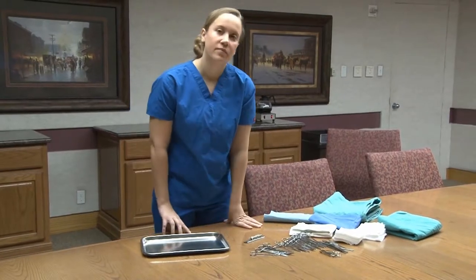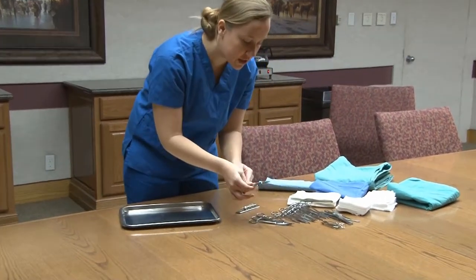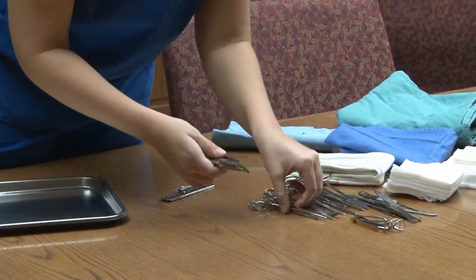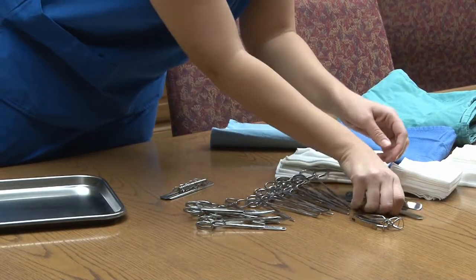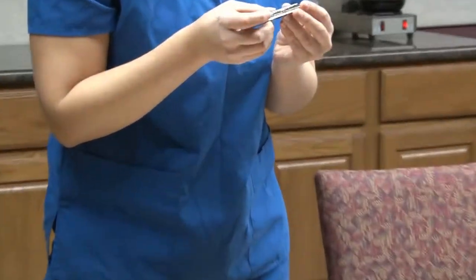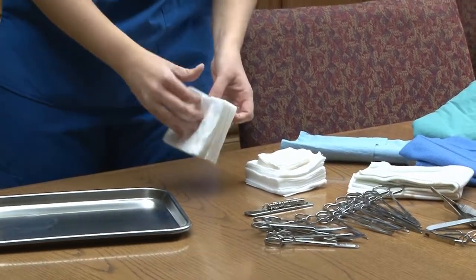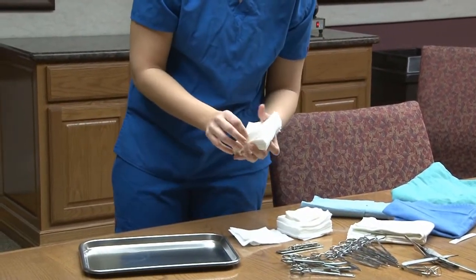Before loading the pack, the student counts all instruments, gauze sponges, suture needles, and other material. I'm counting the instruments to make sure I know how many I have so that when I'm finished with surgery, I can ensure that no instruments have been left inside the patient. I count the needles as well, and then my gauze sponges. Gauze sponges are an item that has commonly been left behind in patients and can cause really bad issues, so you want to pick each one up and count it individually.